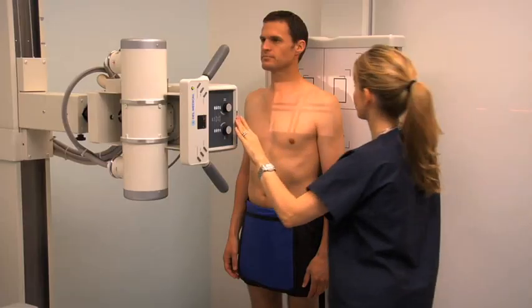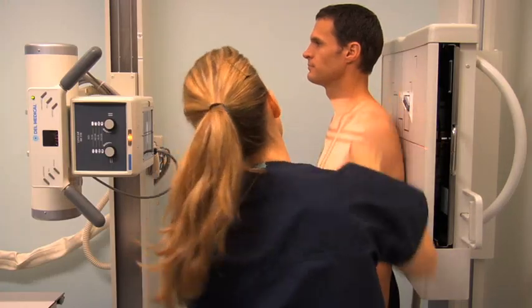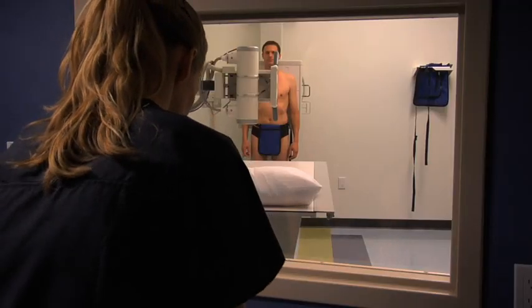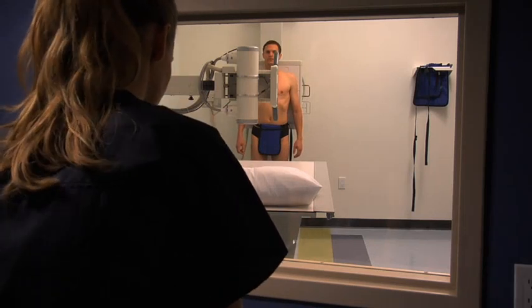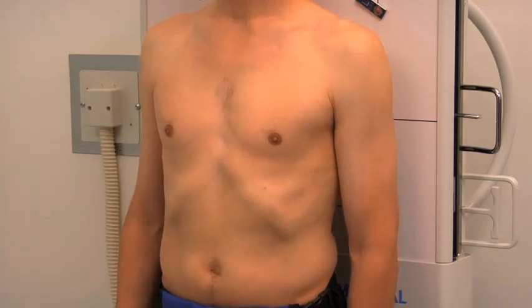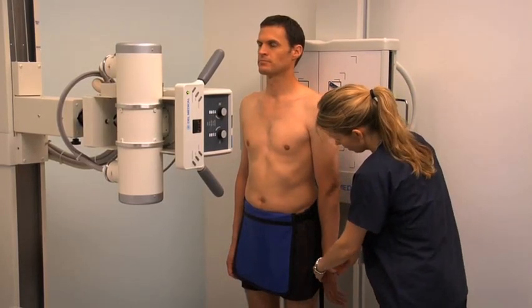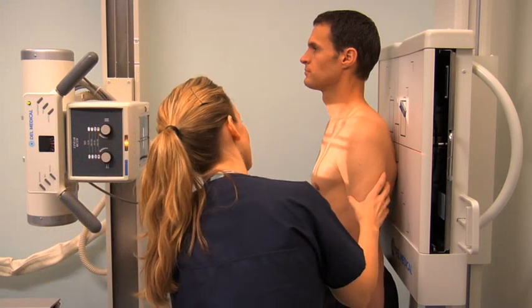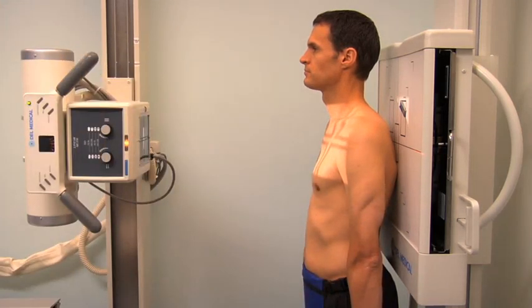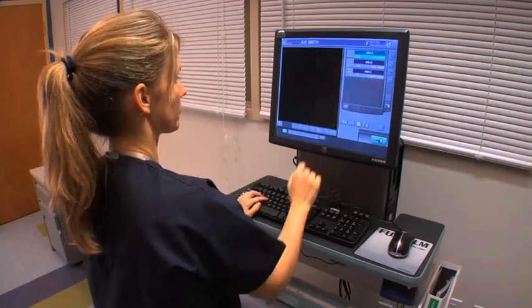Collimate the light field to include the patient's proximal humerus, upper scapula, and the lateral half of the clavicle. Place the appropriate lead marker within the collimation field. Proceed to make any adjustments in the exposure settings. Instruct the patient to keep still and hold their breath, then prep the machine and expose the cassette. Ask the patient to relax and breathe normally, then remove and process the cassette. To obtain an AP projection with internal rotation, assist the patient to medially rotate their arm until the back of their hand faces their body. The central ray and collimation are the same as for the AP shoulder with external rotation. Check the exposure settings, expose the cassette, and review the images for both projections.